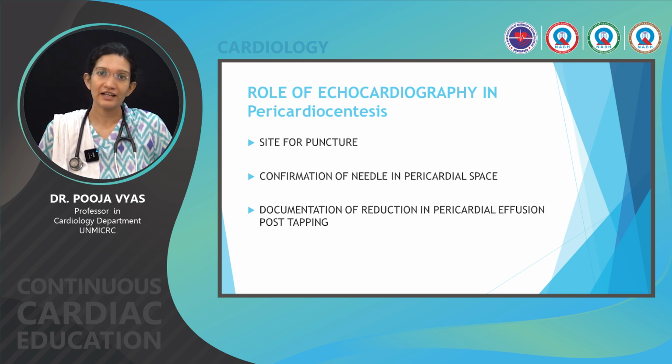Echocardiography even helps us while we do pericardiocentesis. It gives us an idea where to puncture for pericardial effusion. We can even confirm our needle is in the pericardial space while performing the procedure, and we can document reduction in the pericardial effusion after tapping using echocardiography.